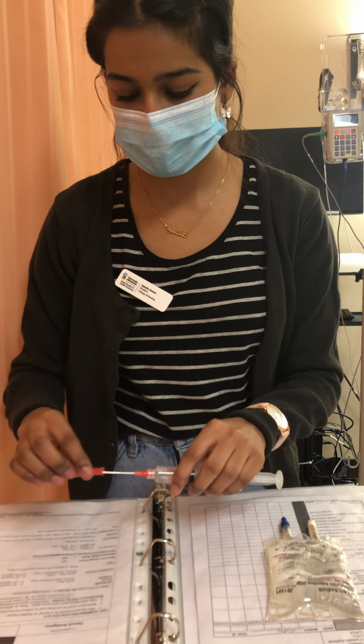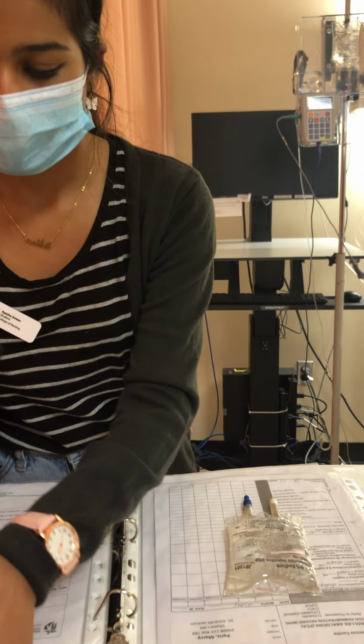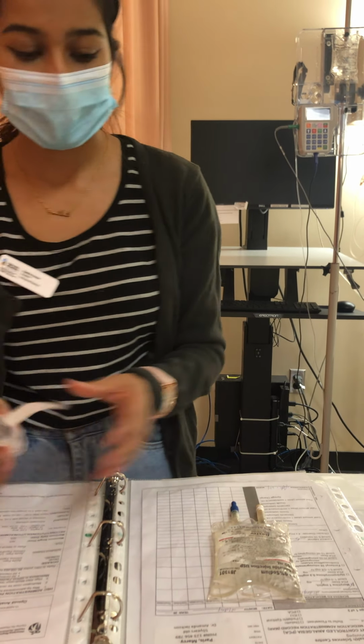Okay, so I've done that. And I'd be using the scoop method to ensure safety. Then I'll attach this label to my syringe to make sure I don't get the medications mixed up. Okay, so I've done that.